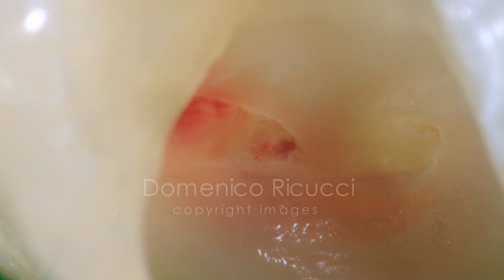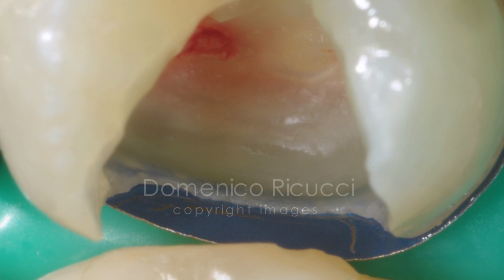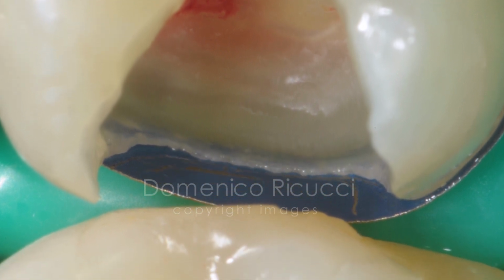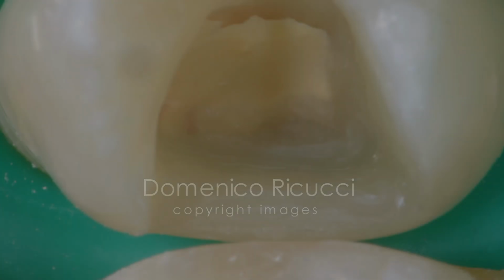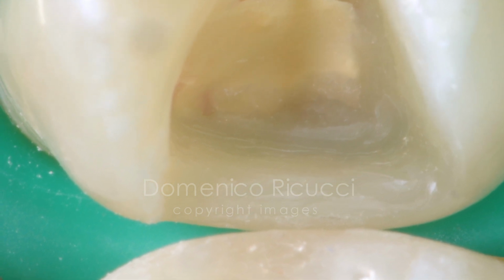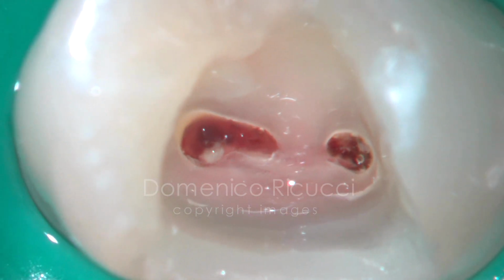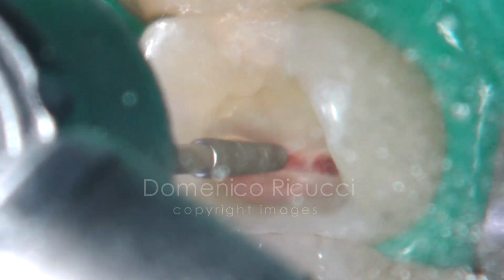Partial pulpotomy is the next step. Preliminarily, the distal wall is restored with composite for optimal isolation. The pulp is isolated with a base during acid conditioning. Pulpotomy procedure is initiated with a long neck sterile diamond burr.